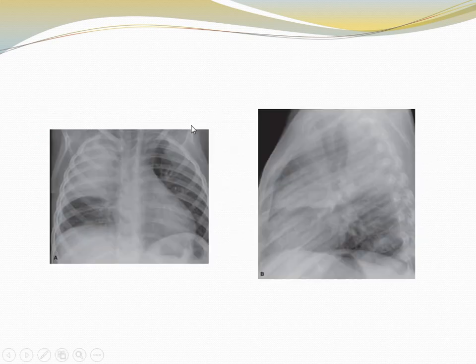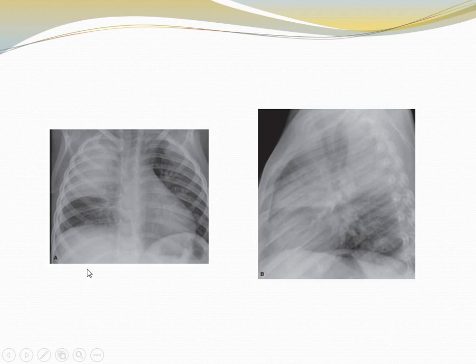This is the chest radiograph, PA view and lateral view, showing opacification of the right upper zone. The fissures are not displaced, so there is no volume loss due to the bacterial infection.